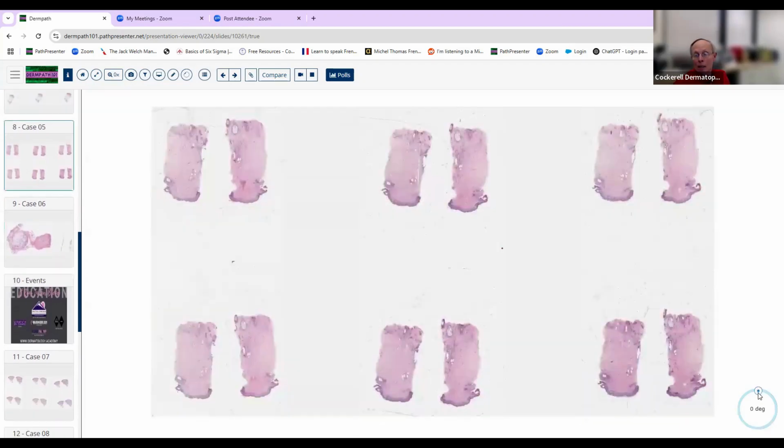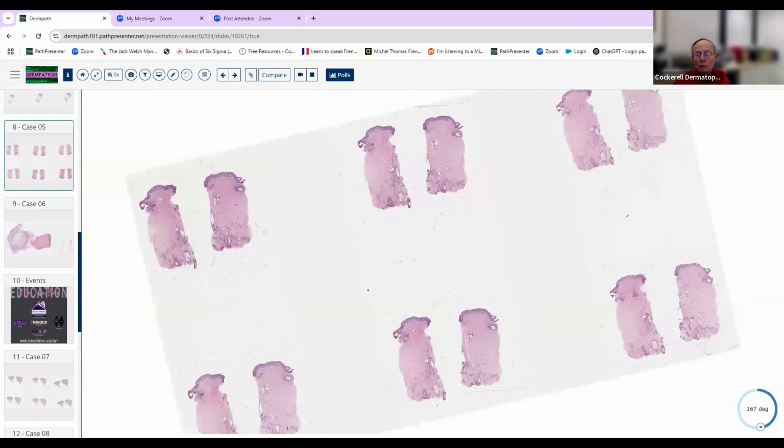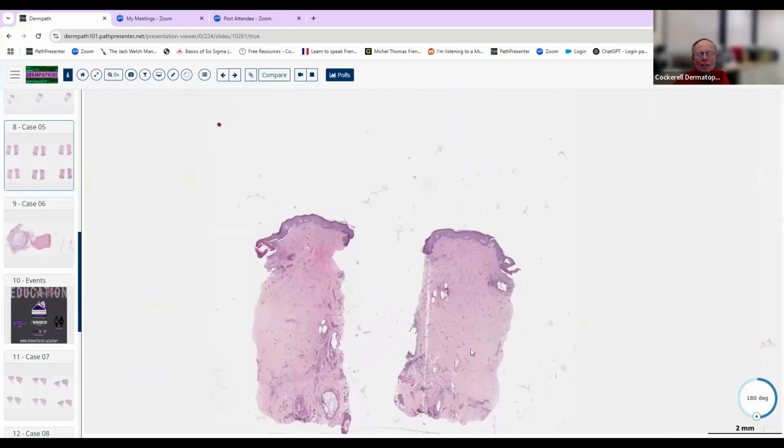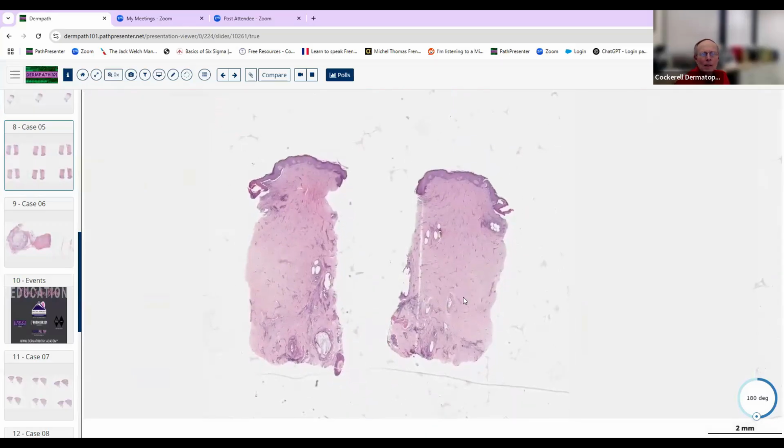Okay. All right, here's another punch biopsy. And this one, once again, probably not going to be something you're going to encounter precisely on the boards, but it does make some good teaching points here. It's a punch biopsy, and again, what part of the body are we on? At low power, it's kind of hard to tell for sure, but notice that there are these hair follicles that are deeply rooted in the subcutaneous fat. There's not very many of them. There's only about 3, where normally with a 4 millimeter punch or even a 3 millimeter punch, you should see about 8 to 10.